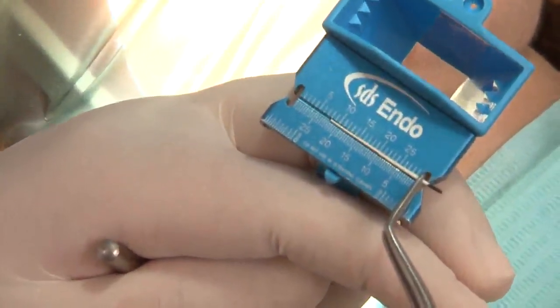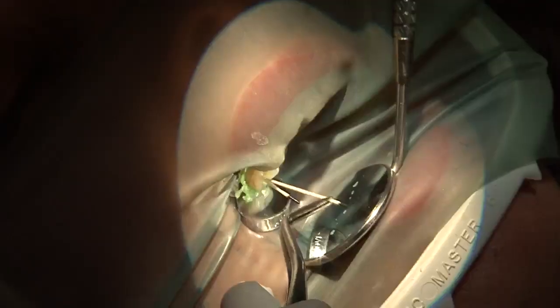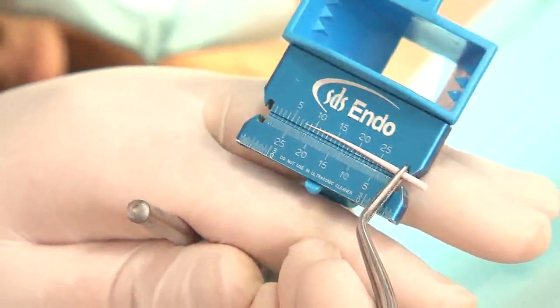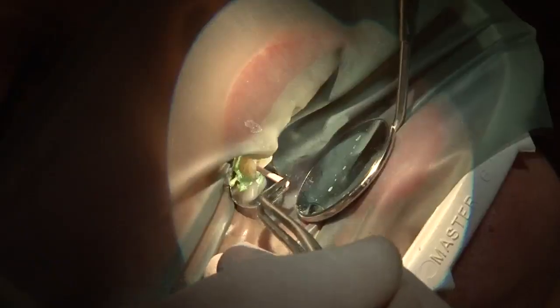The next step is to dry the canal with paper points. We adjust the 40 paper points to the exact working length. Now it's time to fit our master cone using the RealSeal material. Again 22 millimeter. We need to be sure we have a small tug-back at the last millimeter. If you don't have a good tug-back like here, we can cut like one millimeter from the master cone, and again adjust the 22 millimeter and try it back, in order to have this good tug-back or friction between the master cone and the canal in the apical area.